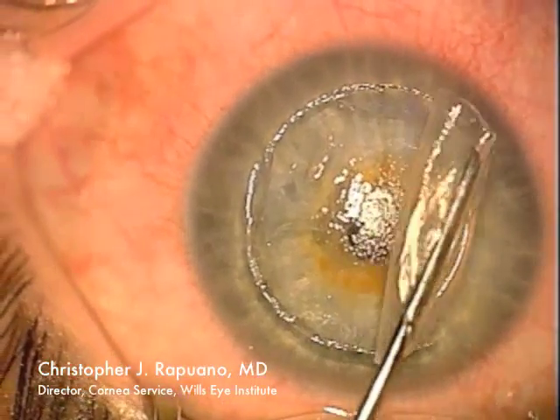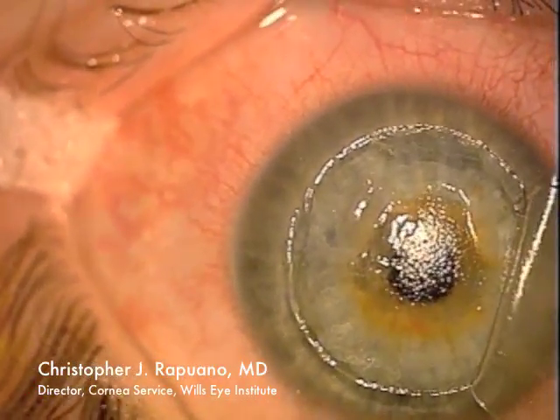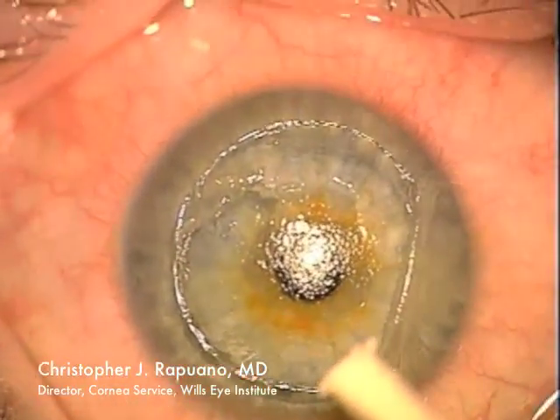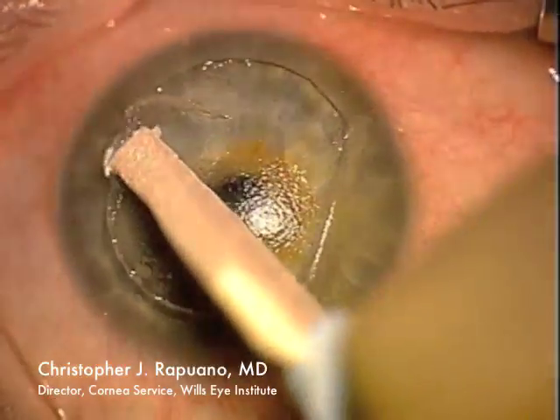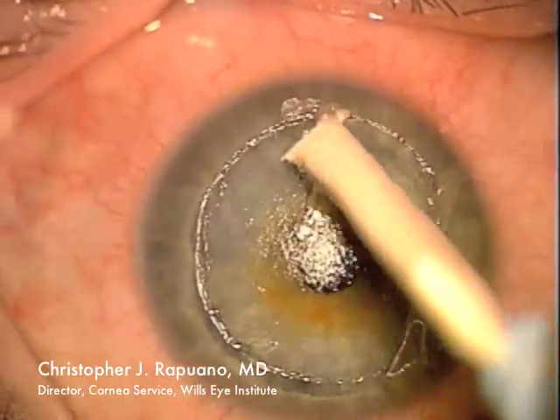Once the entire flap has been mobilized, I can lift it up and out of the way. There are significant epithelial ingrowth cells on the body of the cornea or the corneal stroma. Here I'm lifting them up with a Wexel cellulose sponge.